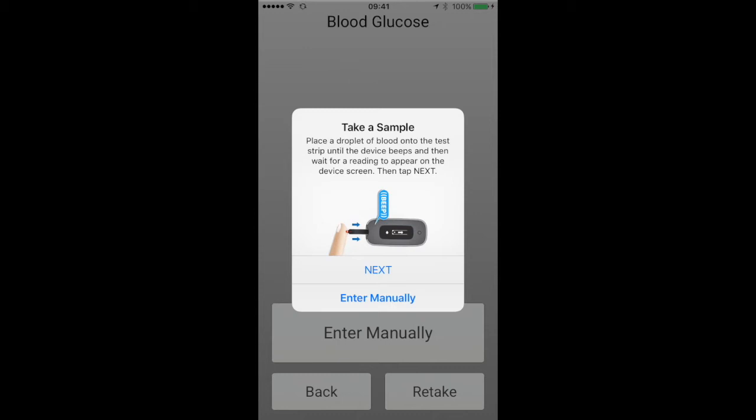On the app screen, you will then be given additional instructions on how to take the sample and apply the droplet of blood to the test strip.